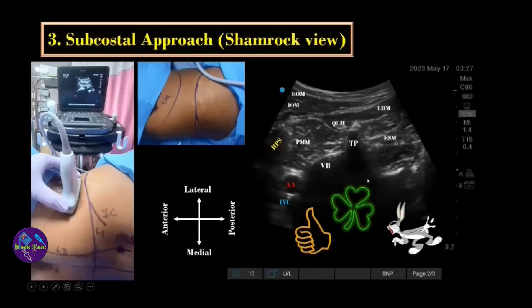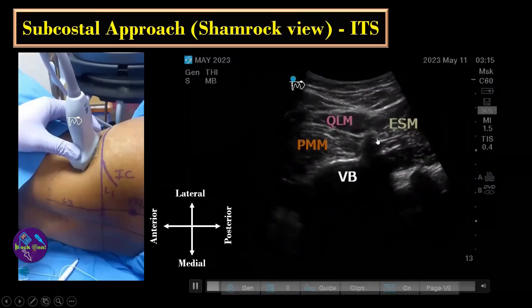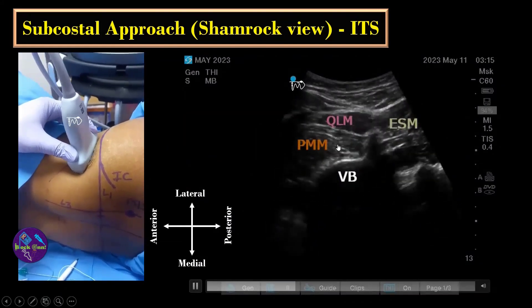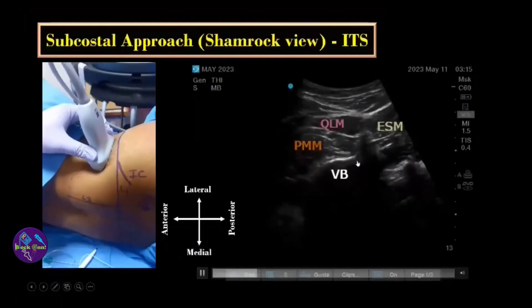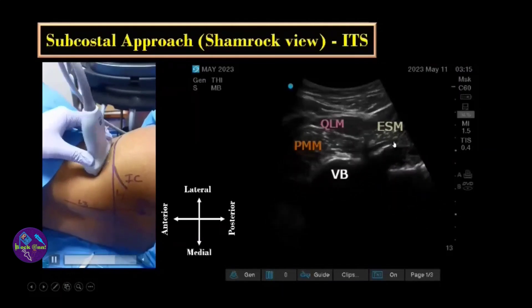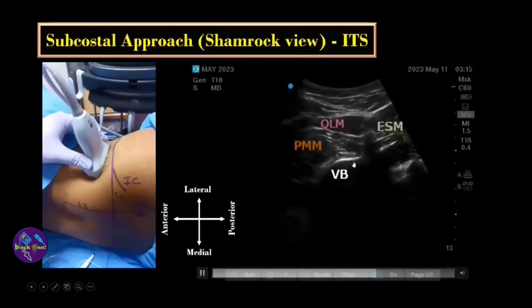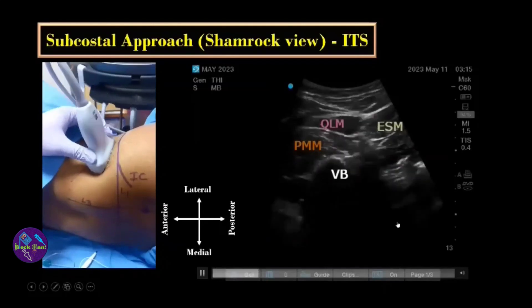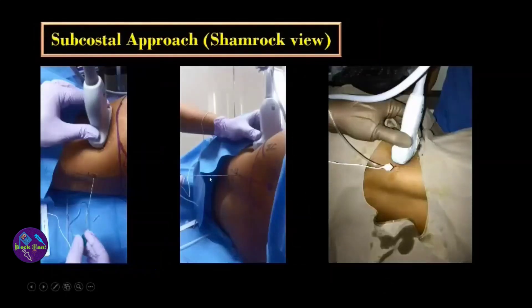Pattern recognition is very important before identifying the lumbar plexus. Once you recognize the pattern, the next step is to remove the transverse process from your view so you can advance the needle towards the lumbar plexus element. By caudal or cephalad tilting you can remove the transverse process from view; the lumbar plexus element comes out from the intervertebral foramen into the psoas compartment. Needle insertion can be done 4 cm lateral to the midline or close to the probe, where needle visibility is very good as the ultrasound beam is exactly perpendicular to the shaft of the needle.